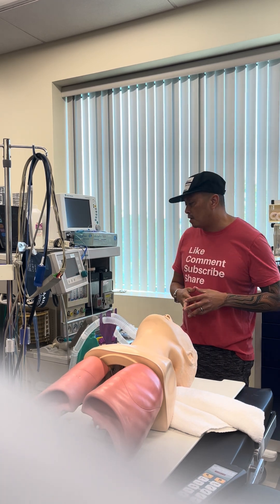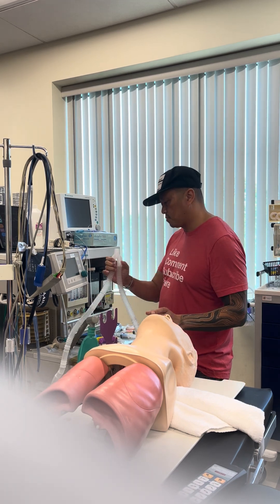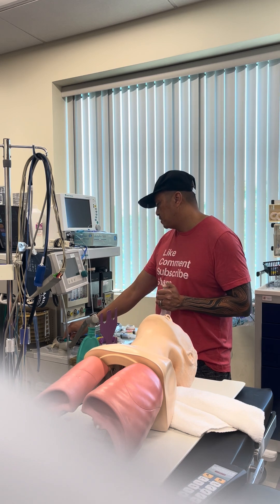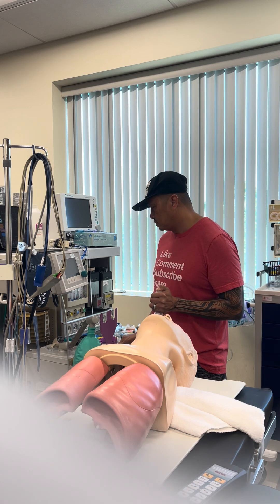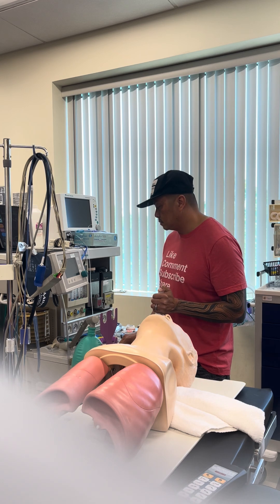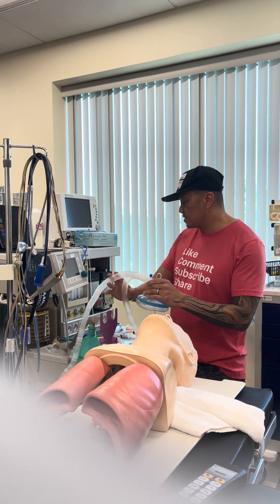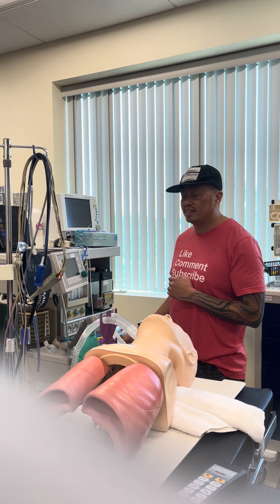Next, I'm going to check my machine. I'll cut off the pressure and check to make sure that it holds pressure. And it does, so I'm going to open it and make sure the pressure releases, which it does. So I'm going to reconnect the face mask, switch onto the vent mode, and make sure my bellows are inflating and that they're appropriate.